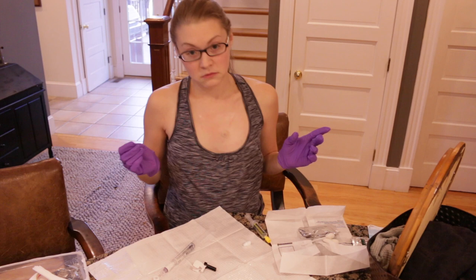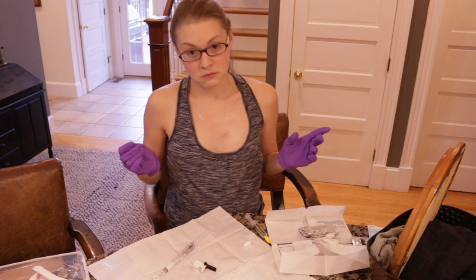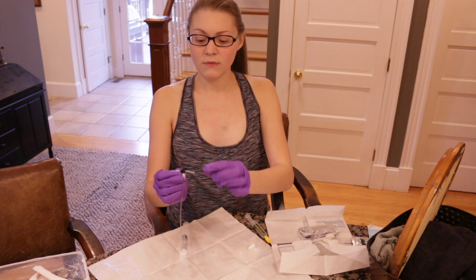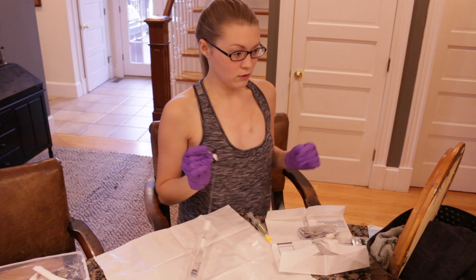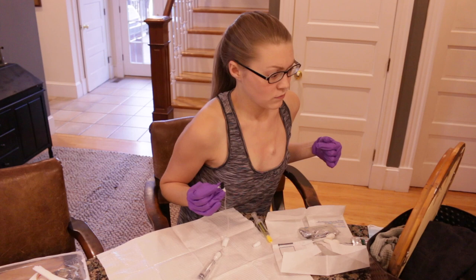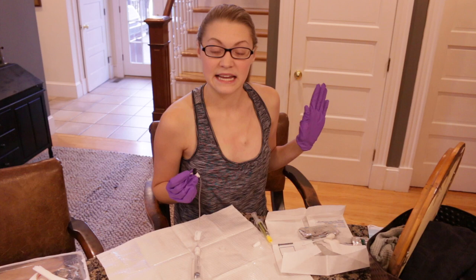The next step is putting the needle in. Usually the needles come with a little cover over the needle part — just take that off. Make sure you figure out how to grip your needle well so that you can see and feel like you can hold it well. Your hands are sterile, your chest is sterile. You'll want to wait a minute or two and let it air dry — don't blow on it or anything, just let it sit and let it dry.